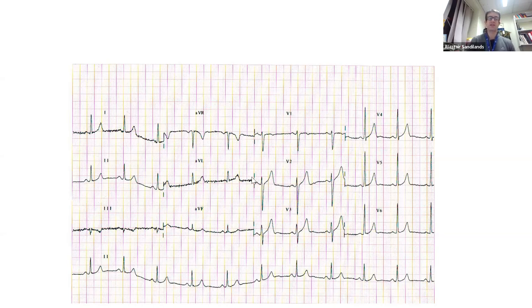So next we go to the axis. Let's concentrate on our limb leads now. We want to know what is the most positive lead. So you either say 1 or 2 is the most positive, and we've got a normal axis. That's all you need to know. We don't need to work out the exact degrees, we just need to know the axis is normal. Really what we're looking for is AVL massively positive: is it left axis deviation? Is lead 3 massively positive, to say that it's right axis deviation? It's another way of looking at it. So we have a normal axis.